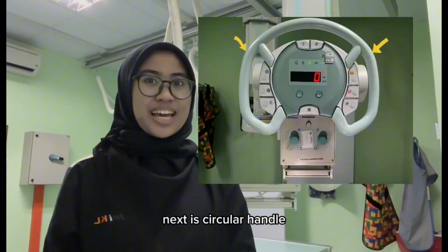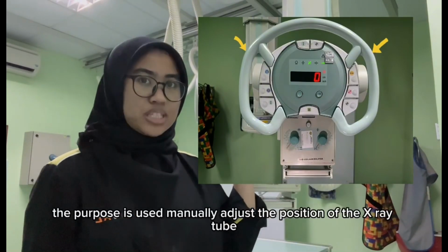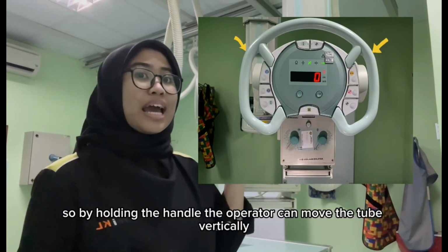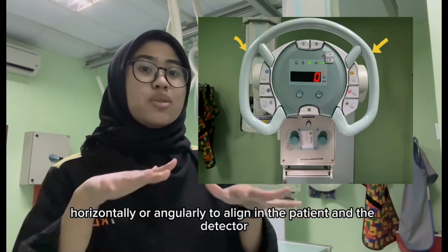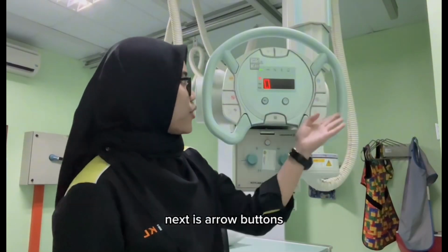Next is the circular handle. The purpose is to manually adjust the position of the X-ray tube. By holding the handle, the operator can move the tube vertically, horizontally, or angularly to align it with the patient and the detector. Next are the arrow buttons.